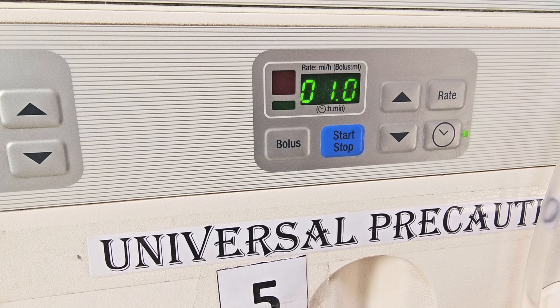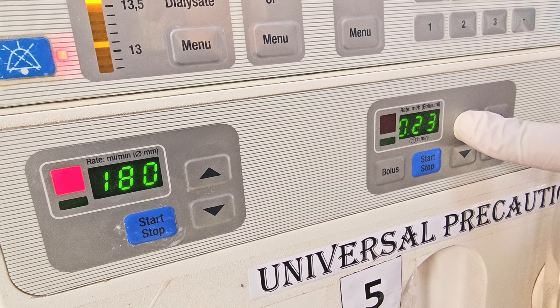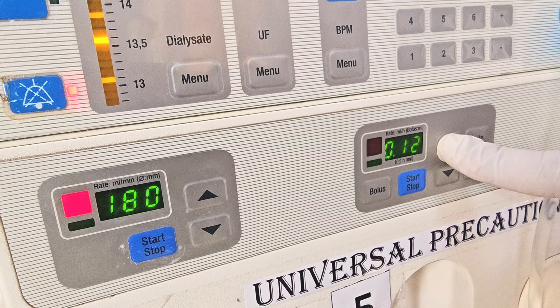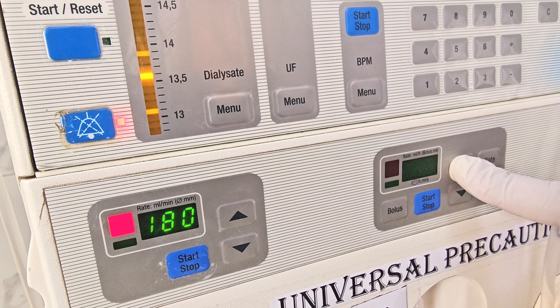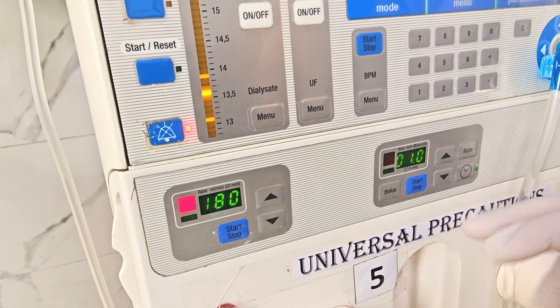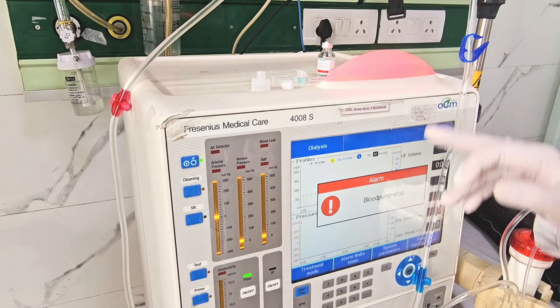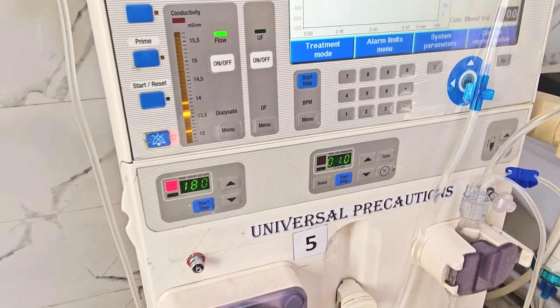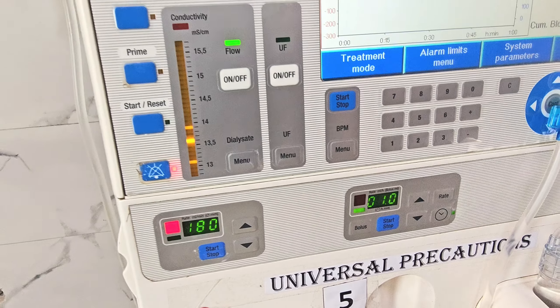The heparin parameters are being set — at what interval and what dose to give. On the left side you can see the pump speed at 180, with up and down controls to adjust speed. The heparin bolus is now being given. The machine is showing a red indicator light because blood has not yet been detected in the blood detector. Once blood is detected, dialysis will officially start — for that, the patient must be cannulated and blood brought into the arterial circuit.